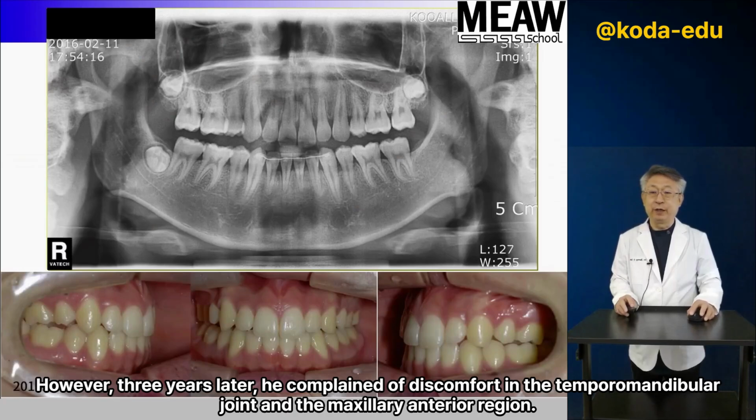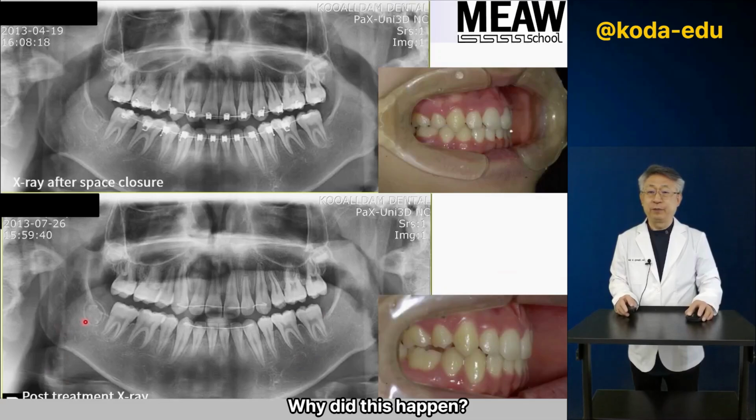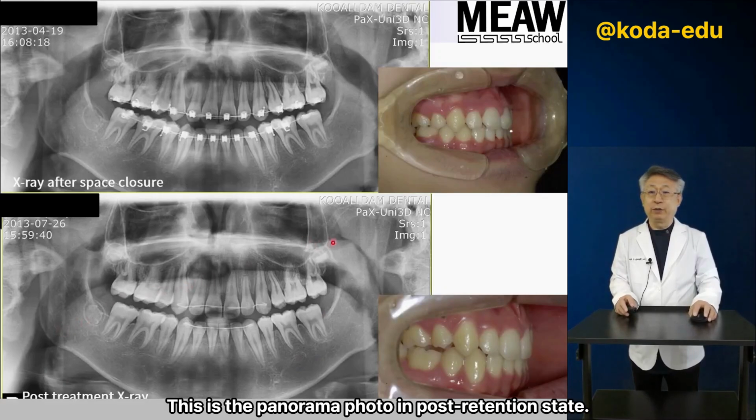However, 3 years later, he complained of discomfort in the temporomandibular joint and the maxillary anterior region. What is the occlusion like? There is open bite tendency in the premolar and molar region. Why did this happen? This is the panorama photo in post-retention state.